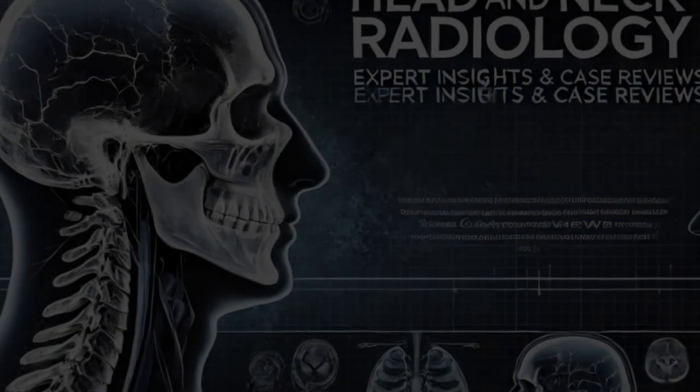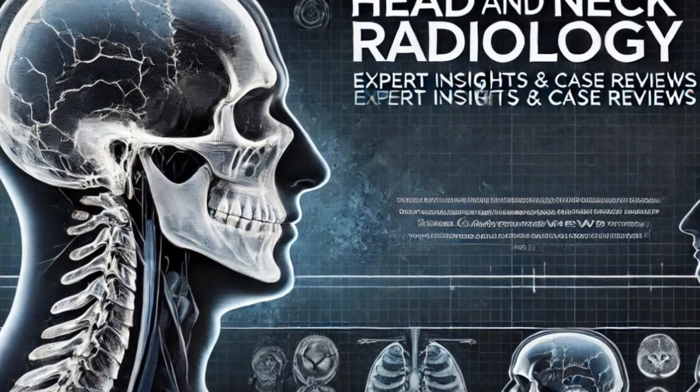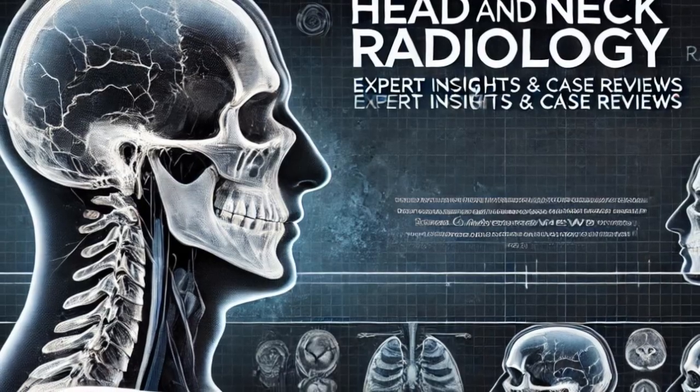In conclusion, carotid body tumors are rare but highly characteristic lesions of the carotid space. Recognizing their imaging findings is essential for proper diagnosis and management. I hope you found this review useful.